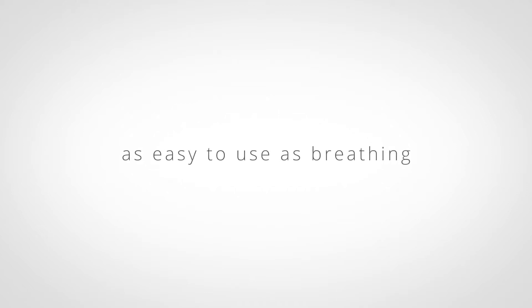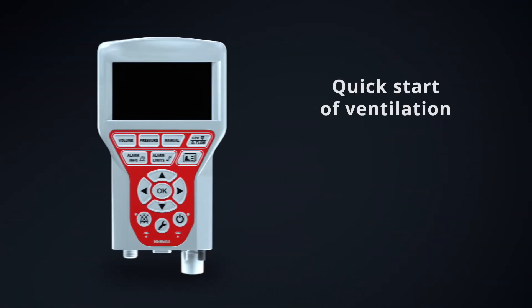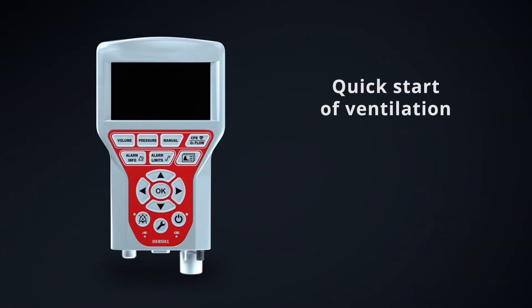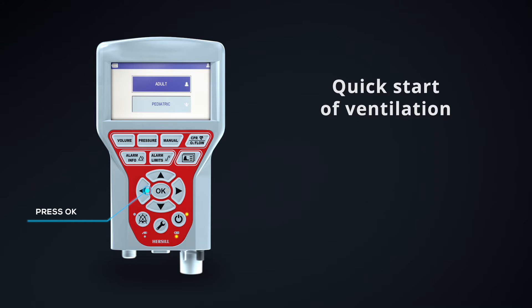As easy to use as breathing. To start ventilating the patient, we press the power button. We select adult or pediatric and confirm by pressing the OK key. And we press OK again to start ventilating.